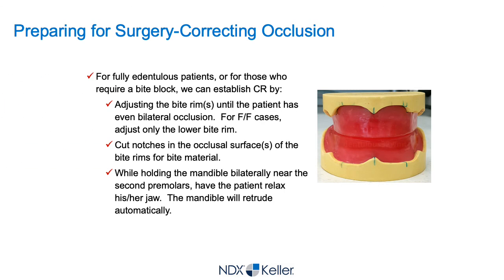If we do have an edentulous patient, we have to go through a denture making process. Dr. Reddy is going to pay for the laboratory fee, so you would need to do bite rims and setup, just like you would for a normal denture. Many times the person has terminal dentition, so it's more taking models with good borders and a bite so that we can create the provisional prosthesis.